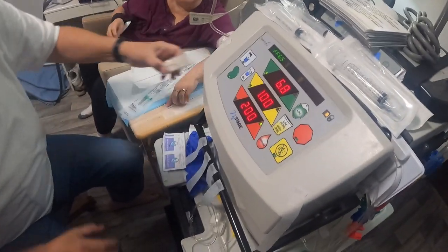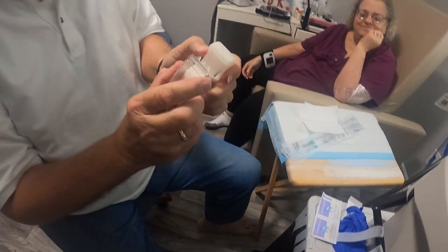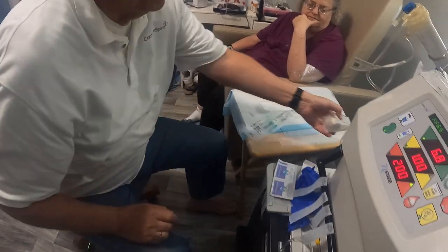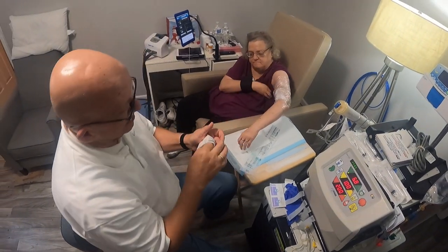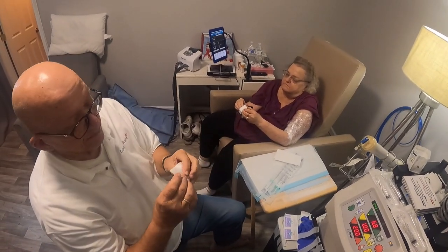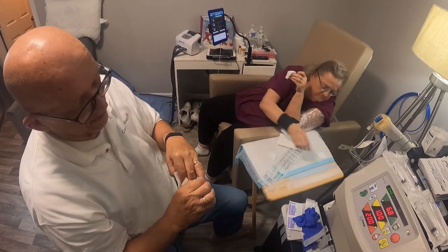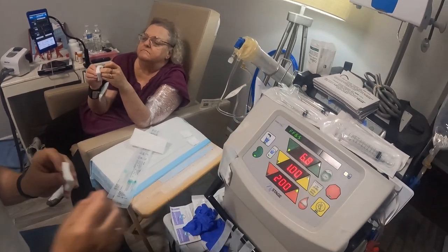That's clever. We have this little fancy one for paper tape. It's broken and they don't make them anymore, so I had to feel. With paper tape, you put it in here and push down on it, and it cuts the tape for you. Now we've got four pieces right here. She's going to count out seven, and I'm going to count out seven. Hold this end over. Put that right in the middle, and we're going to put that right there.